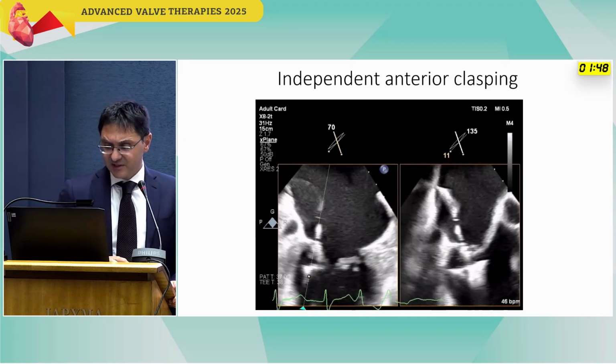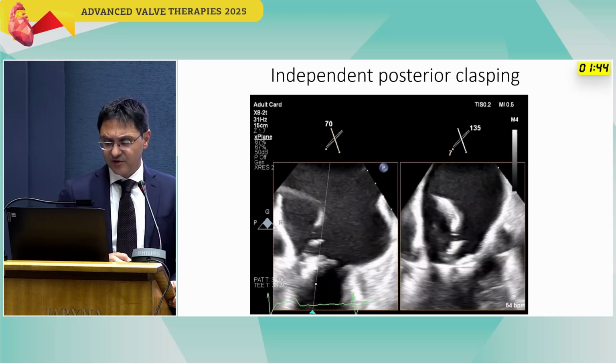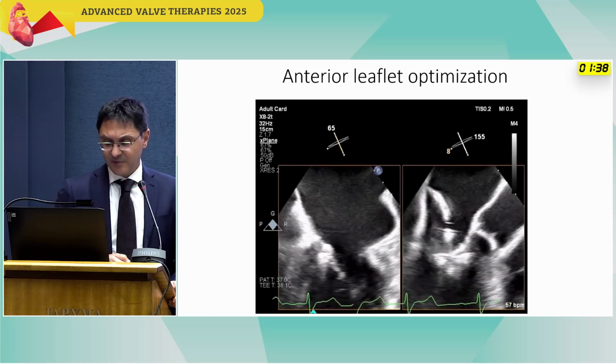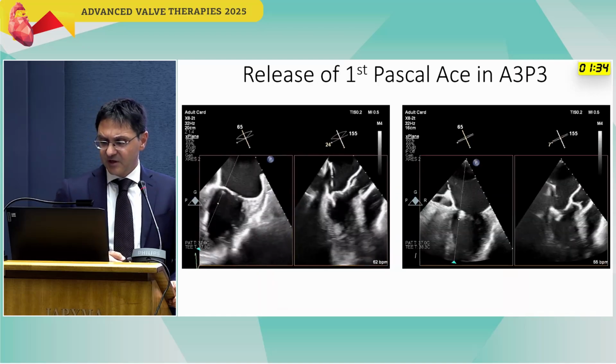We followed with independent anterior clasping, independent posterior clasping, and then we optimized, here on the right side, the anterior leaflet.